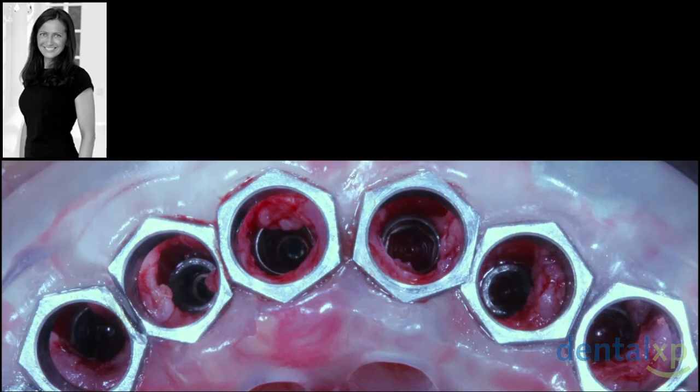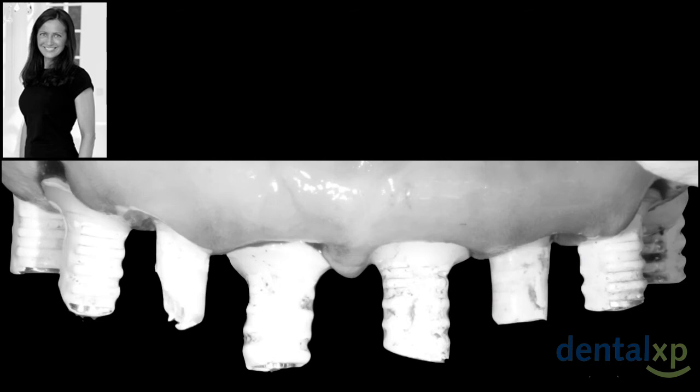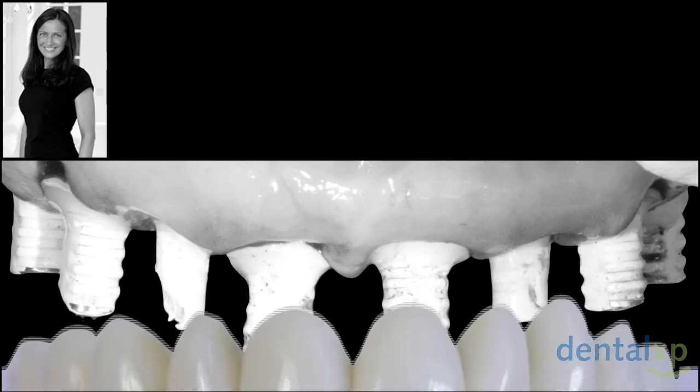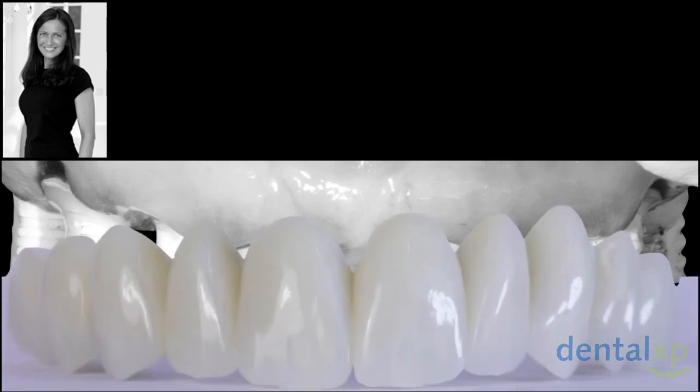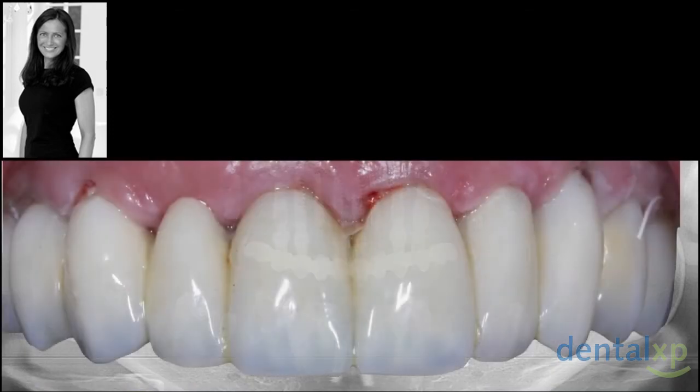Now, this is the situation after extraction of the tooth and the perfect planning of the implant. And we know that having a thick tissue biotype, having the distance to the buccal contour and the precision of the insertion, we will have a good result. These are the screw-retained abutments, provisional. That is how the patient goes home. And this is how she looks after 4 days.